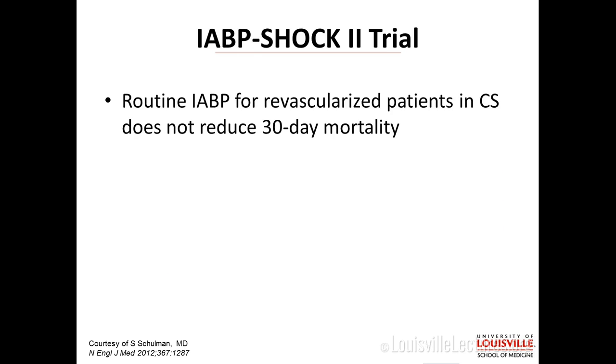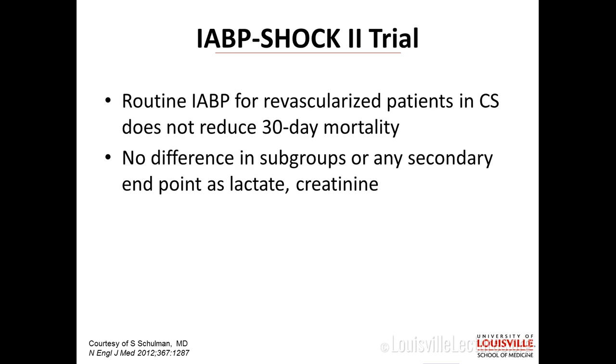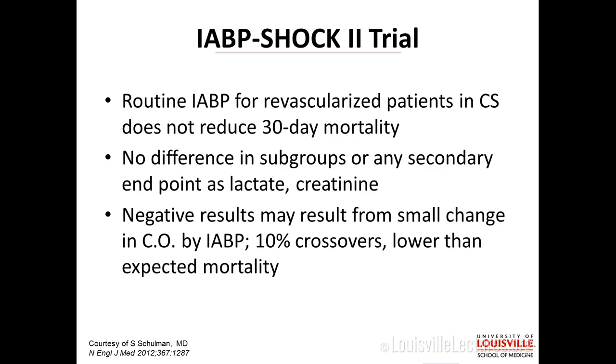So basically the routine use of balloon pump is now not in favor any longer based on this trial. That said, people still do it. And it's still tempting because you have nothing else you can do for these patients and you don't want to pull the trigger all the way to an Impella. So you'll still see it happen, but the data does not support routine use of balloon pump for cardiogenic shock.